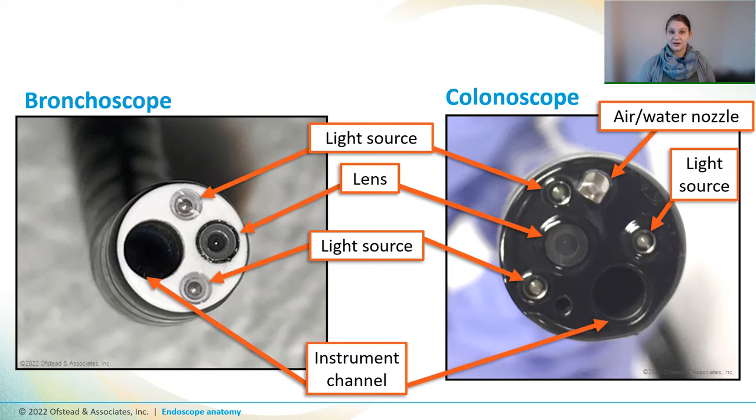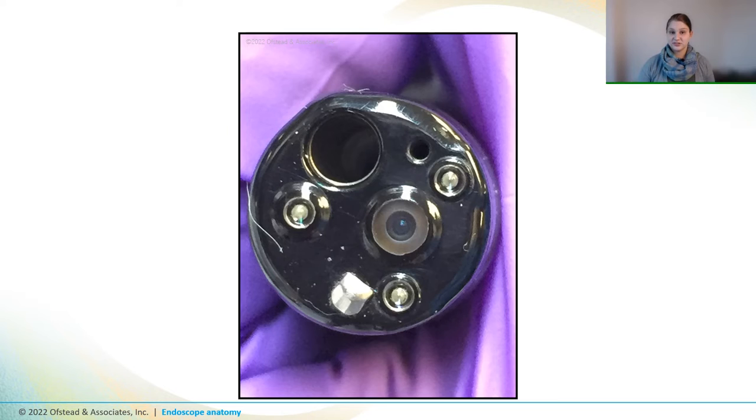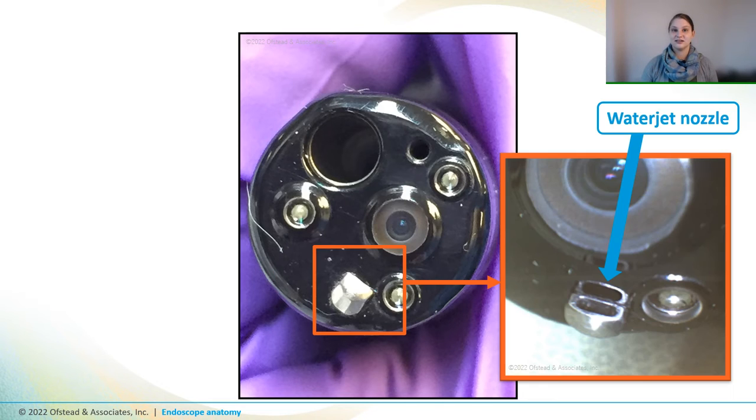The colonoscope also has a water jet that shoots water across the lens during procedures to clean it off so that the doctor can see what they're doing. And it also has an auxiliary water channel that allows the operator to pump more water through the scope. So here's a closer look at the distal end of a new colonoscope. It has a few fibers and little pieces of styrofoam on it from the shipping container. And here's a different angle on the outlet of that water jet channel, which flushes water across the lens. Once you know how that water jet outlet should look, you'll be able to tell if there's still soil or debris in it after you clean it.